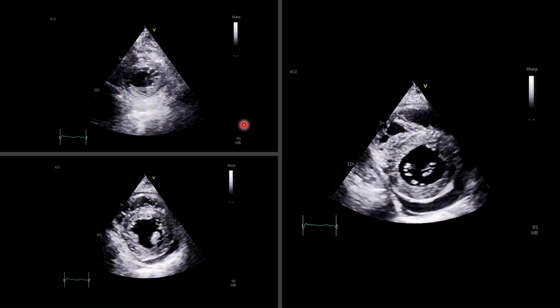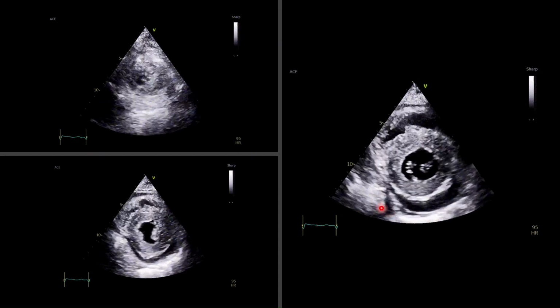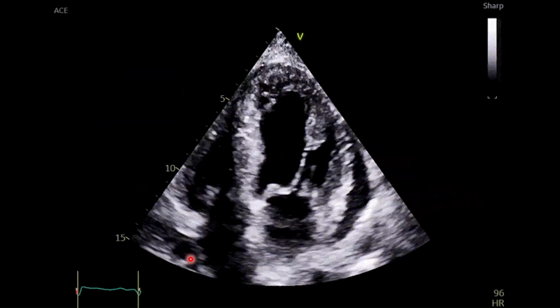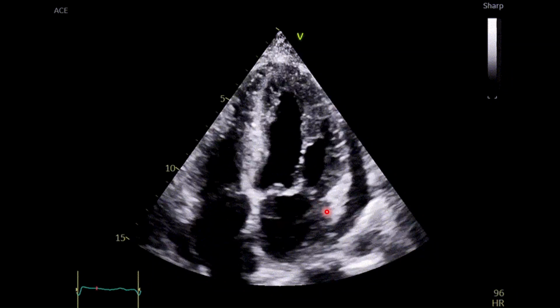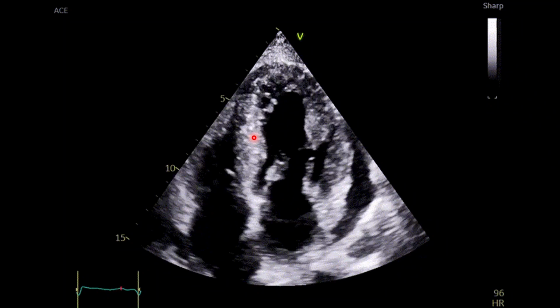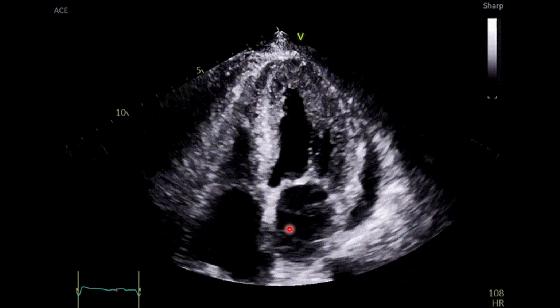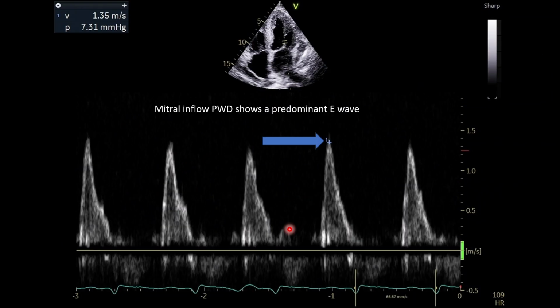And this is a short axis view of the left ventricle, and we can see, other than the pericardial effusion, that there is a mild global hypokinesia. Some more views, and this is the apical four-chamber view. Here, other than appreciating the reduced systolic function, we can see that both atria are enlarged. The two-chamber view confirms the same.